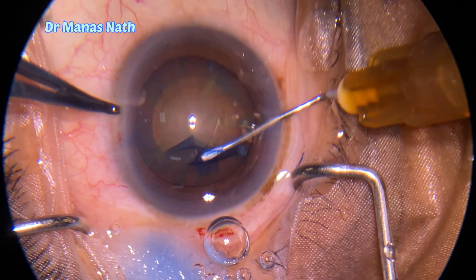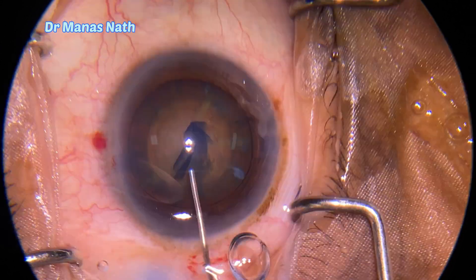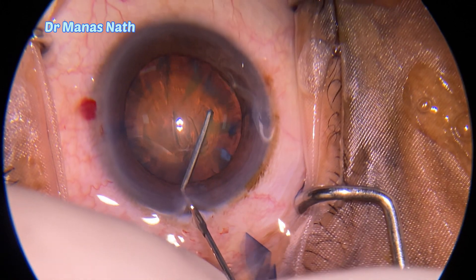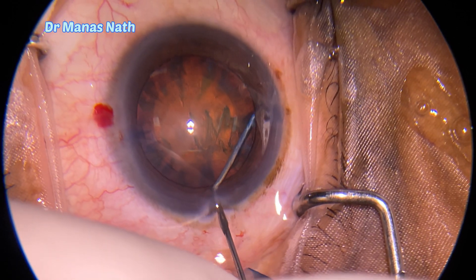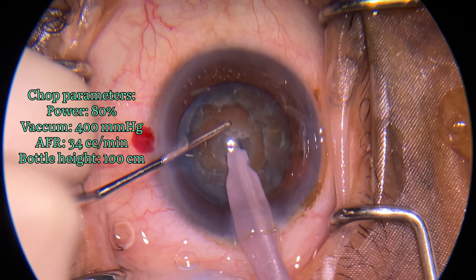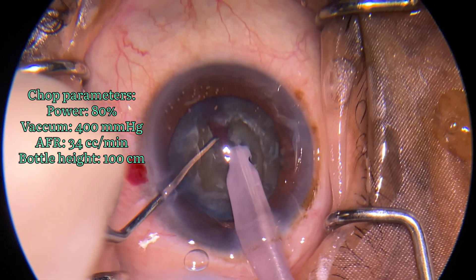Always make sure that the flap is flat. Removing some of the viscoelastics, debulking the chamber, and then started a hydro procedure. One can see the fluid wave. Started nuclear rotation, checking the rotation of the nucleus, and then started my phaco emulsification with the chop technique.